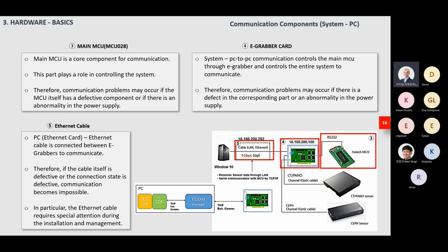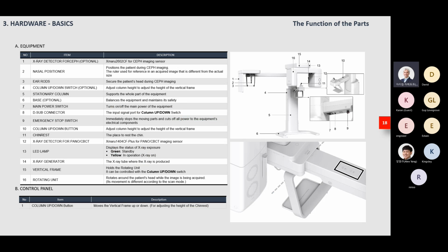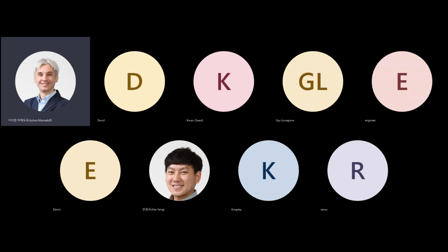And I will show you now a different connection. Before going to the next connection, let me show you more detailed information about the eGrabber so that you have a better understanding and a clearer view of this board.